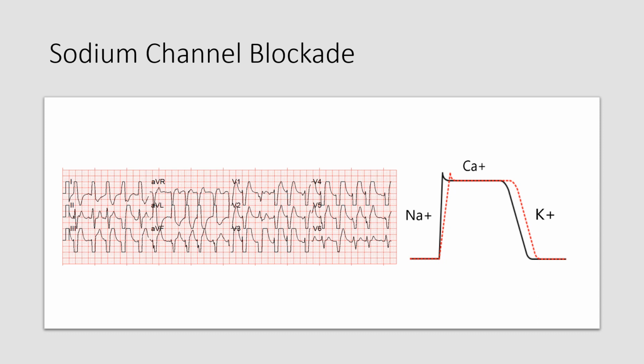Since sodium is the primary electrolyte in motion during depolarization of the muscle cells, as your ventricles depolarize, that's represented on the ECG by your QRS complex. And so if I slow the influx of sodium in, you're going to end up with a wide QRS. Then if you sprinkle in some anticholinergic toxicity, you get the fast heart rate, and that combo makes Benadryl overdose, along with tricyclic antidepressants, toxidromes that can mimic ventricular tachycardia. Both cause the wide QRS through sodium channel blockade, and then increased heart rate through anticholinergic syndrome.